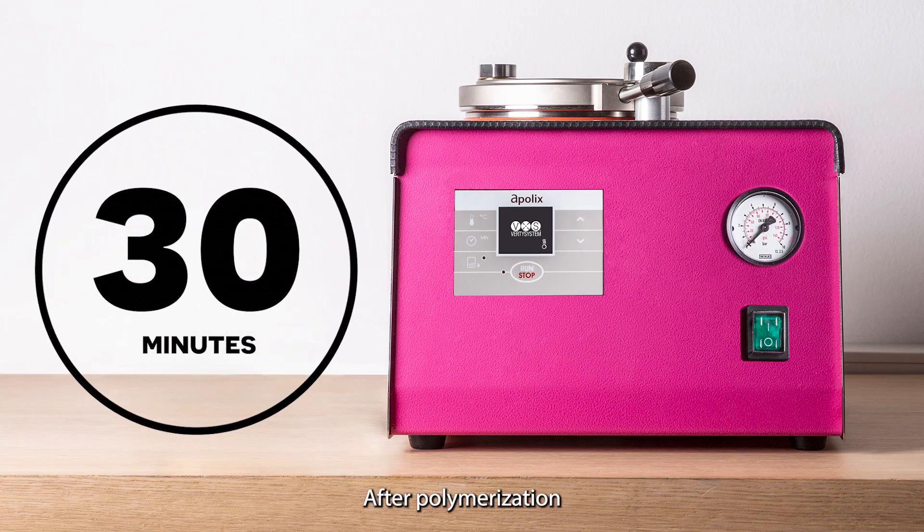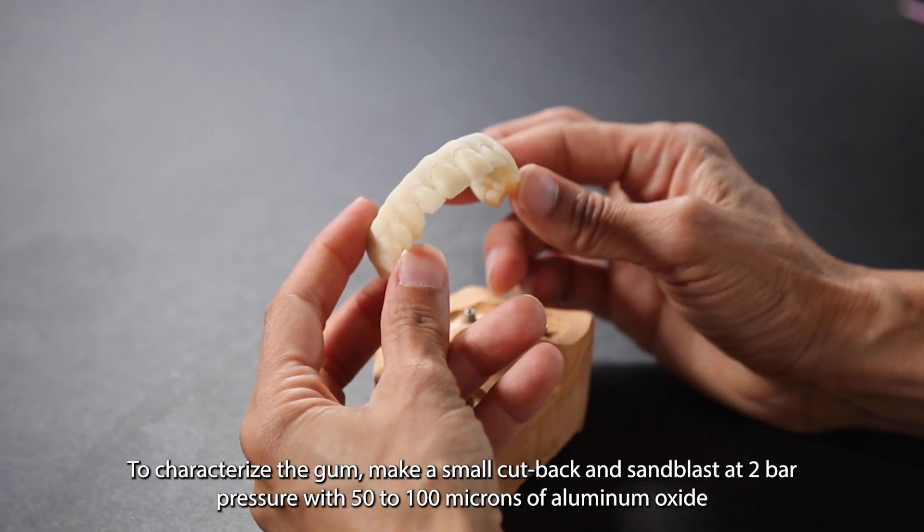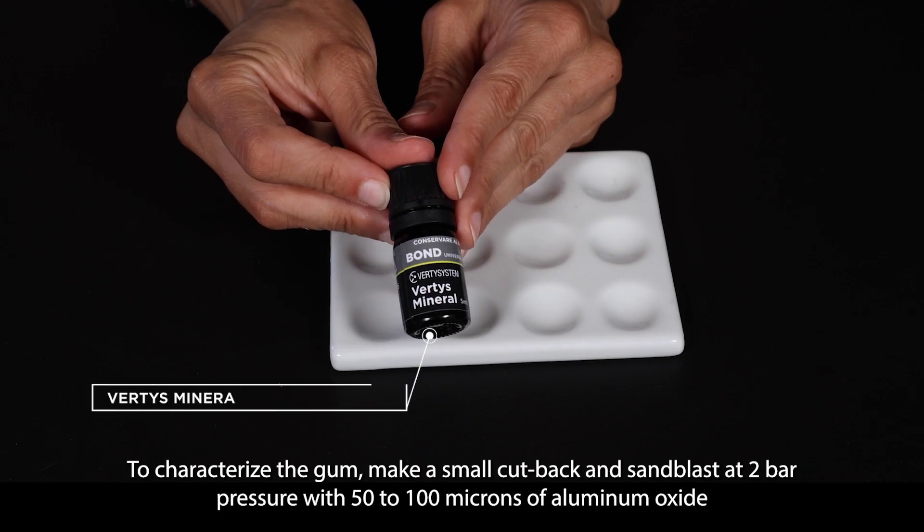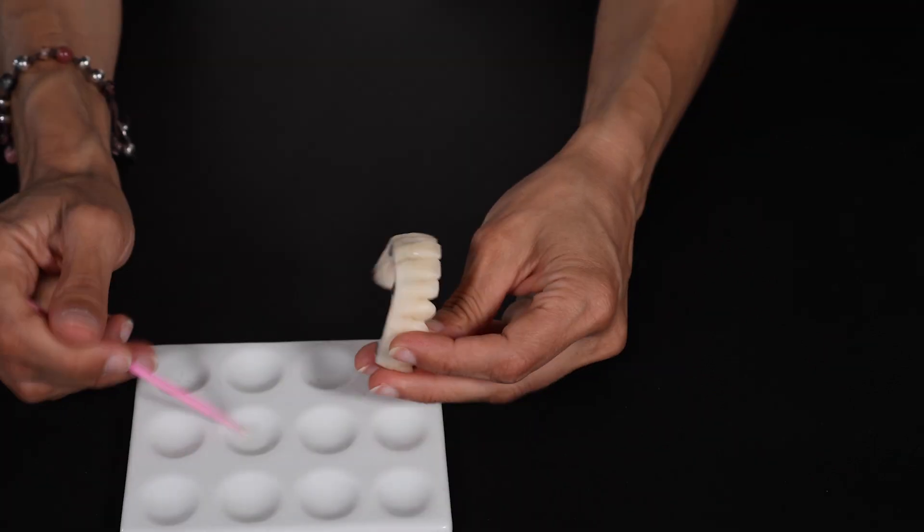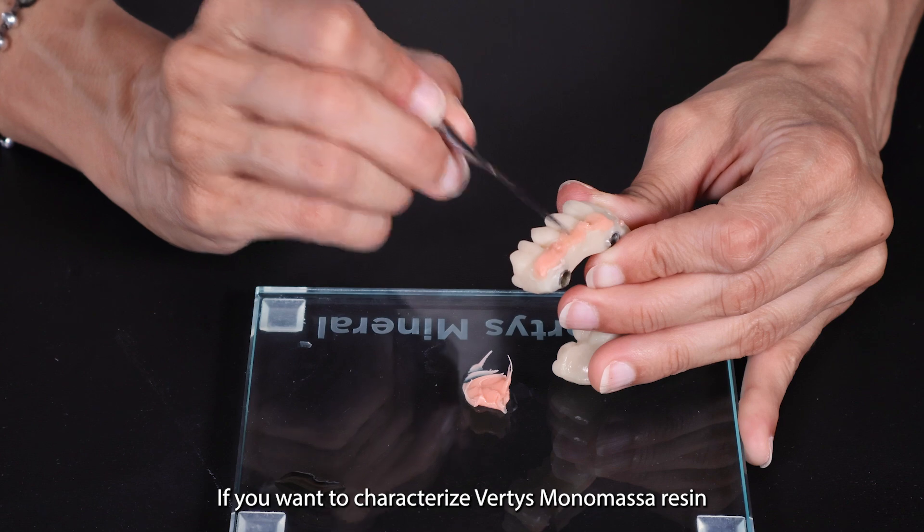After polymerization, open the flask and remove the implant bridge. To characterize the gum, make a small cutback and sandblast at 2 bar pressure with 50 to 100 microns of aluminum oxide. Then apply Vertys Mineral Universal Bond if you want to characterize Vertys Monomassa resin.